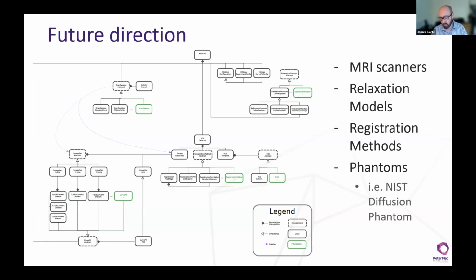We generally like to take a big 3D isotropic image to do that registration, but other people haven't always had that, so sometimes we're doing it more to a 3D slab. It currently supports the system phantom, and we now have it working on a diffusion phantom, but we're doing some accuracy checking before we do a more general release of that.